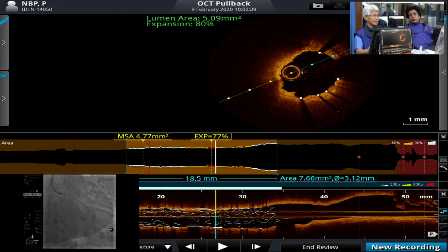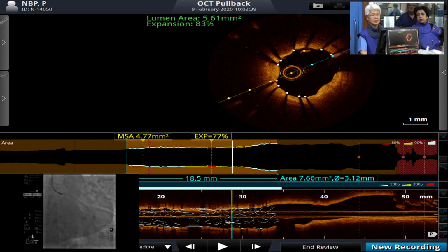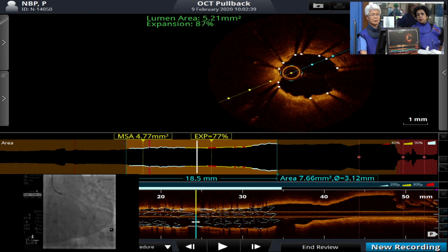If you take it up to dilate to 16 using a higher pressure, it is okay. And if there is a very minimal eccentric growth, calcium is minimal, and the opposite side is completely normal, there is a high risk of perforation because the stent expands into the normal site, right? So it is really image-guided PCI, right? Very, very insightful.